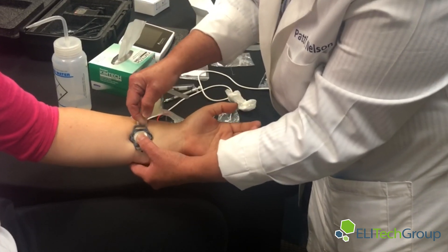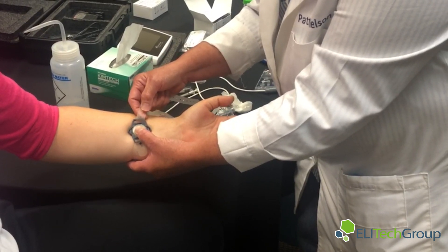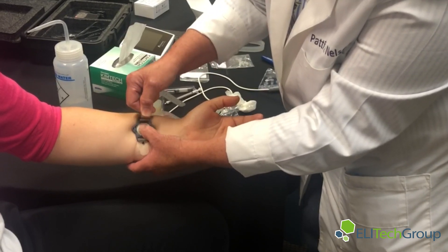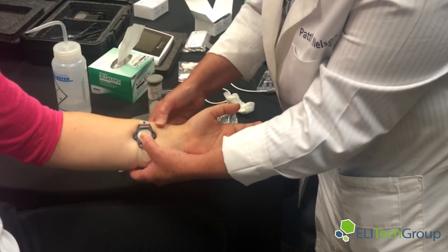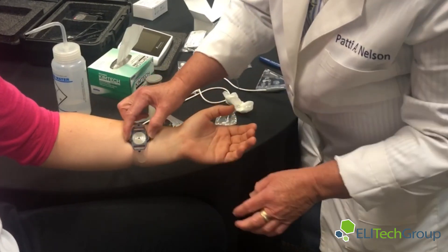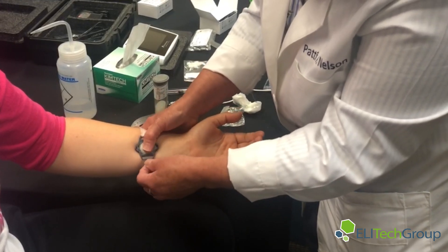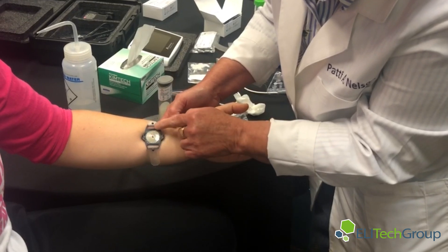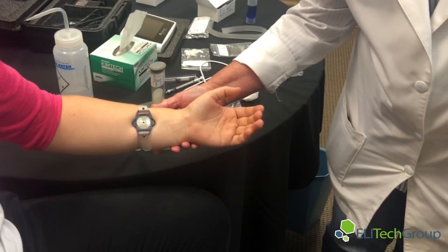This is very important: to prevent a quantity not sufficient result, make sure that the strap is tight — tight enough to be slightly uncomfortable but not hurting your patient. You can see it's not quite tight enough here, so I would go and add another hole. You want to see how the skin comes through a little bit — then you know you have a good attachment to the arm.